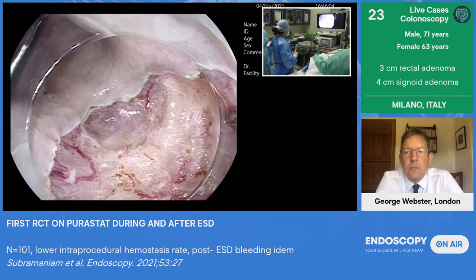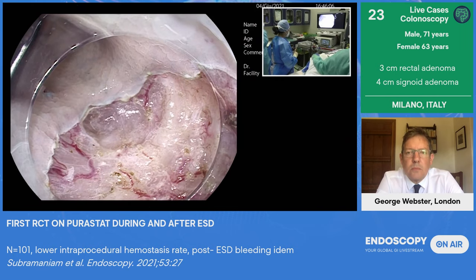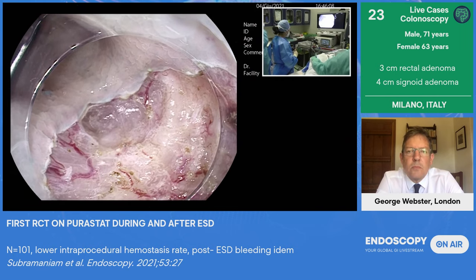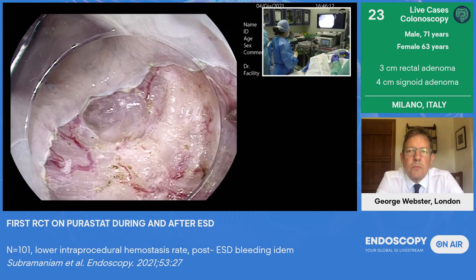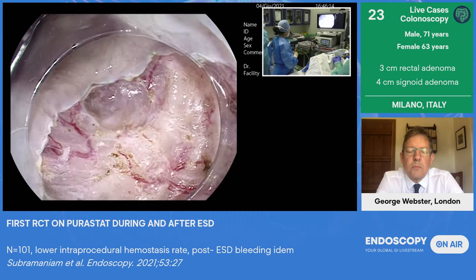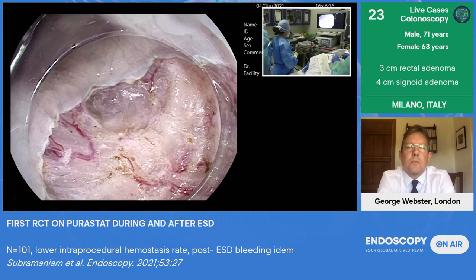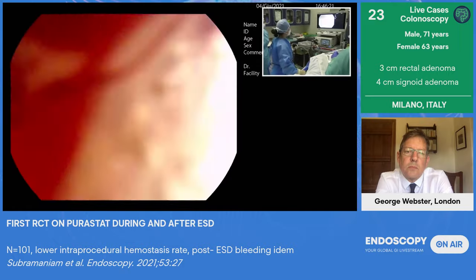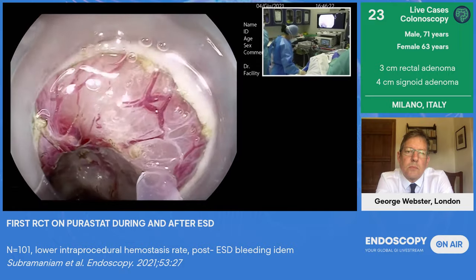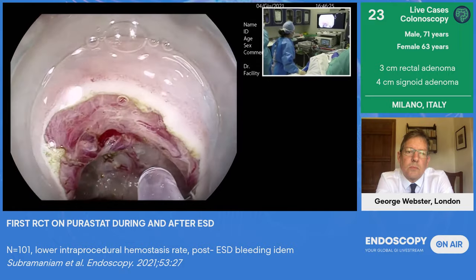So the matter is the size and the skill of the operator, if you're able to perform ESD, as in this case, or EMR. The other fact is that nowadays we have some devices, this one, that help you in achieving an en bloc and make the hybrid technique reach a very high rate of en bloc resection using something that is typically hybrid.